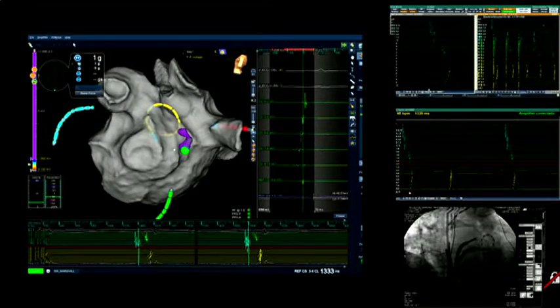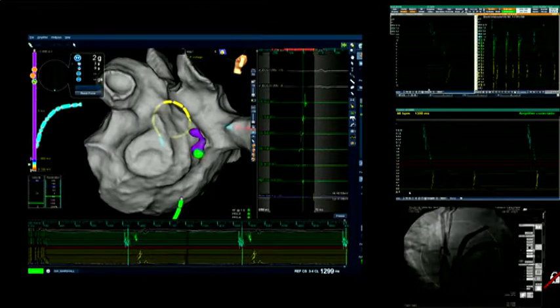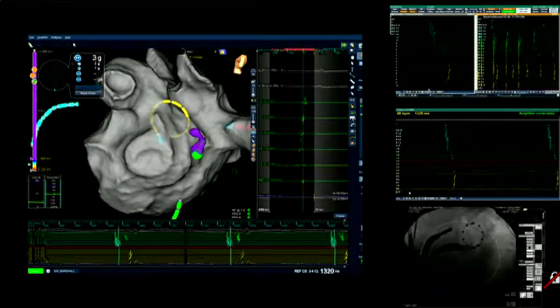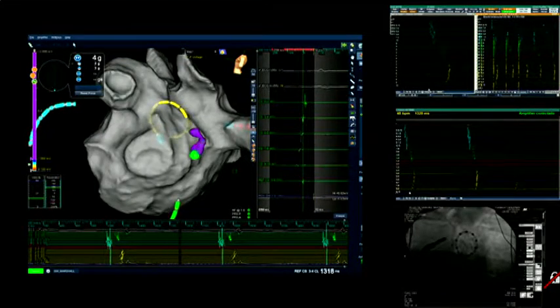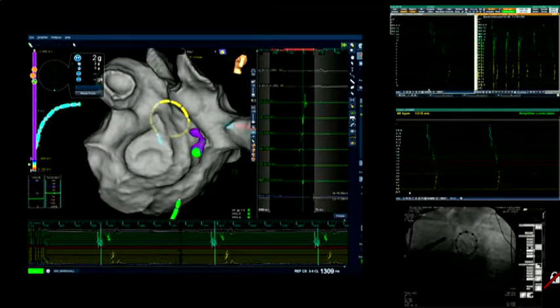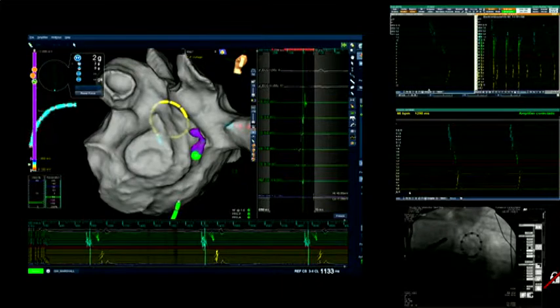it's quite deep. As you can see, let me show you an image in order for you to see it in a magnified image. This is a higher magnification, and you can see the relationship. The balloon is covering. You can show the X-ray image only. Let us see just the X-ray image.